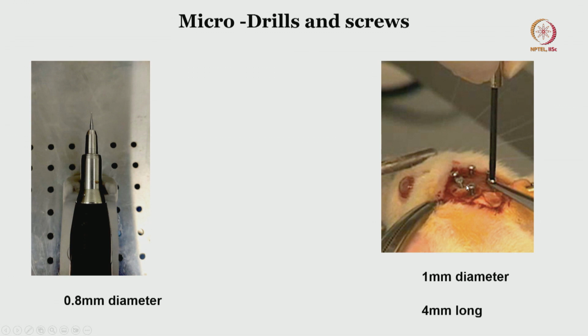We are going to use similar screws as we discussed in craniotomy as well, which give a very good rigid fixation, where the implant as well as the screws become one big blob of acrylic dental cement, all fused together to give a good rigid fixation of your primary implant. So, it is very important to practice this as well.